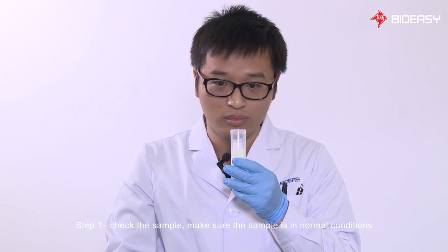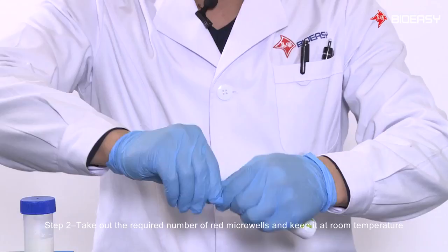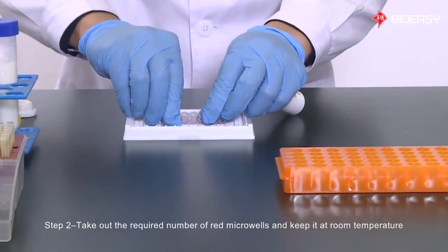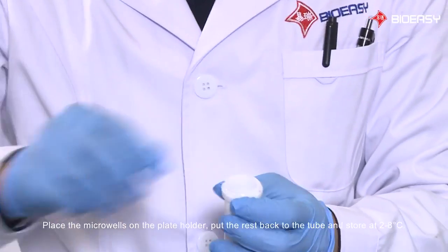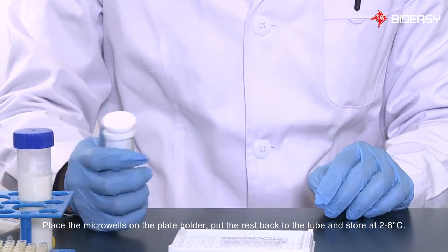Step 1: Check the sample. Make sure the sample is in normal conditions. Step 2: Take out the required number of red micro wells and keep them at room temperature. Place the micro wells on the plate holder, put the rest back into the tube, and store at 2 to 8 degrees Celsius.